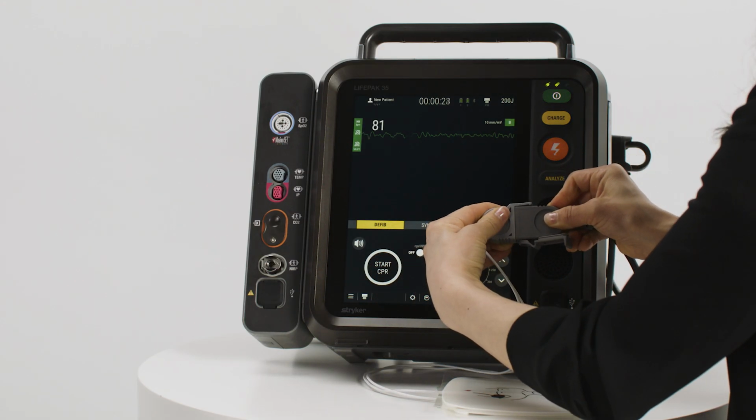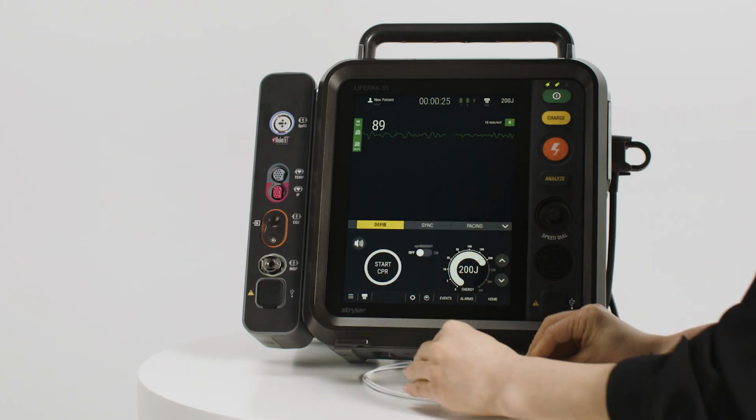You should prepare the patient's skin for therapy electrode pad placement. Apply the therapy electrode pads to the patient's chest in the anterior lateral or anterior posterior position. Confirm the desired energy is selected.